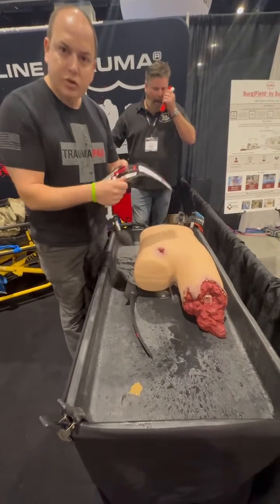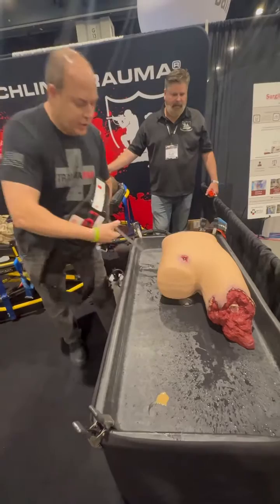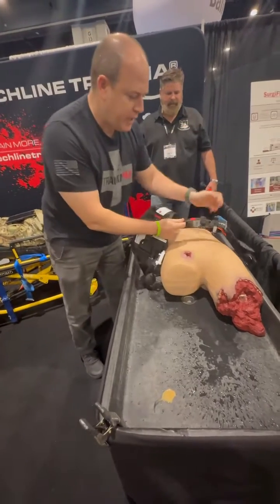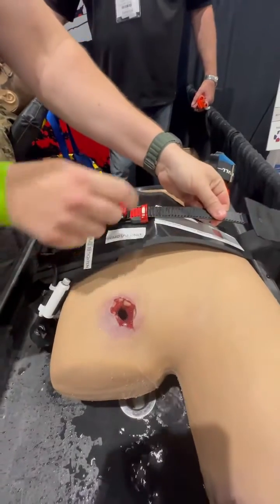I'm going to orient this — always towards me. I lead with this edge here and I'm going to go underneath. You can see how this is red to red. I'm going to insert it red to red, just to this red here.